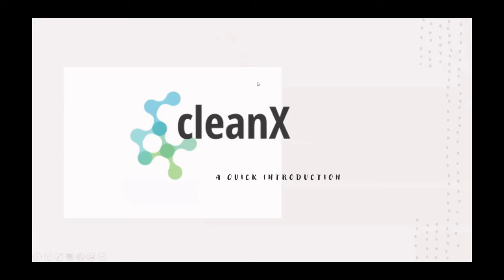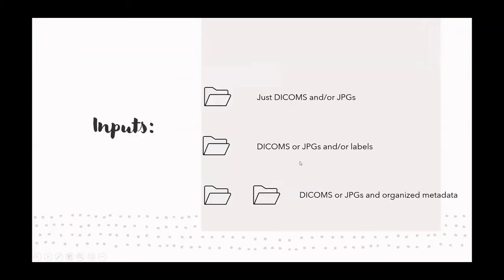The most common question I get about cleanX is, what does it do? Okay, so cleanX was made to ease the process of making machine learning algorithms for chest x-rays.